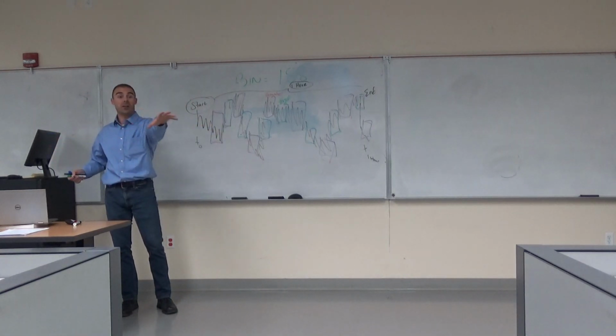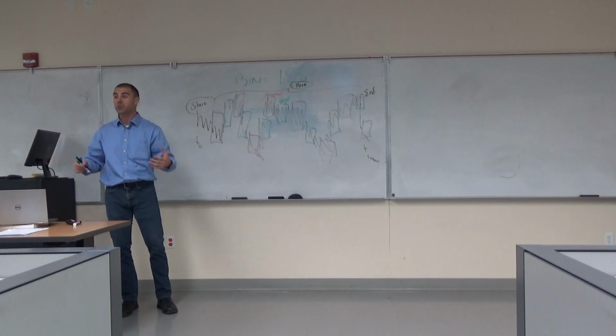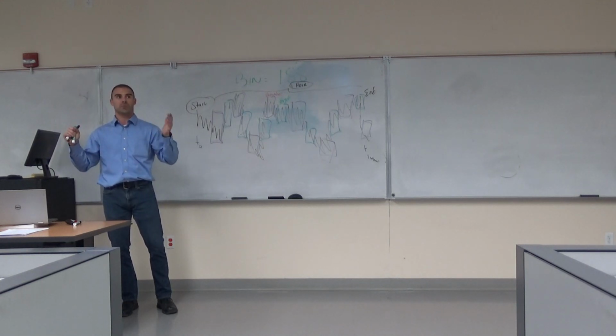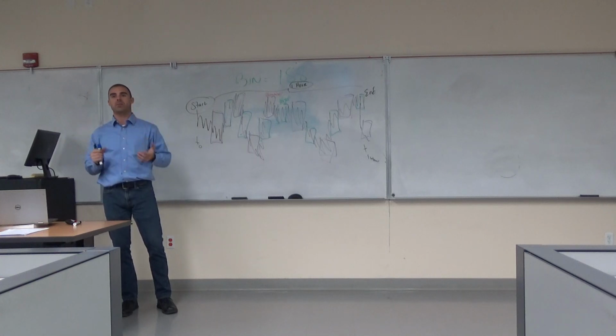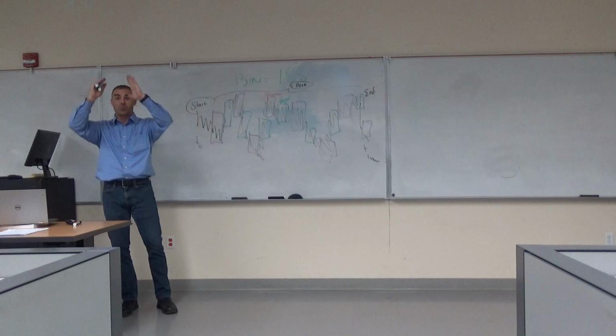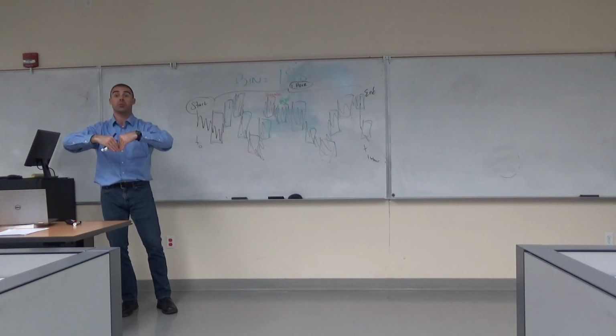Now what you guys are plotting on your 3D Scout topography maps, that's what we're going to call them, topo, which is short for topography, essentially means the shape of that voltage. You'll see that in the colors. Where is it a maximal peak, the red, or a maximum trough, the blue?